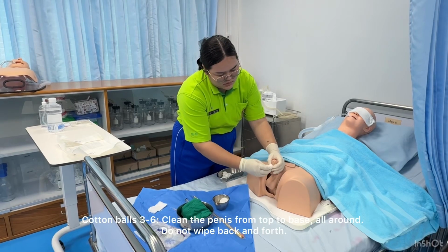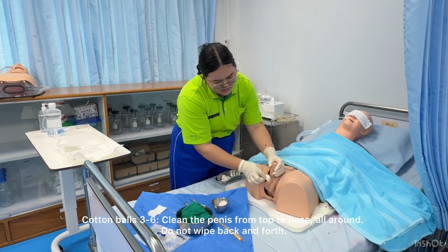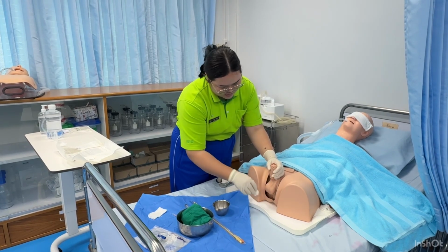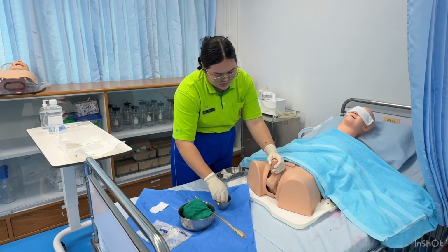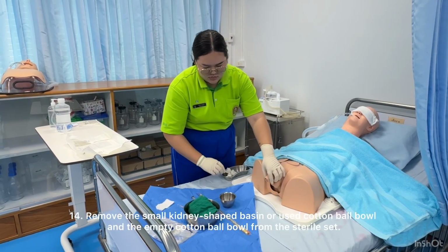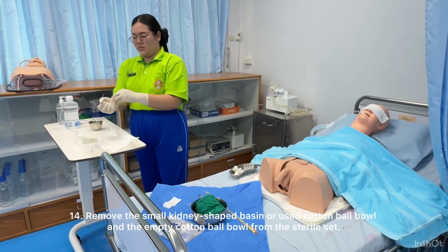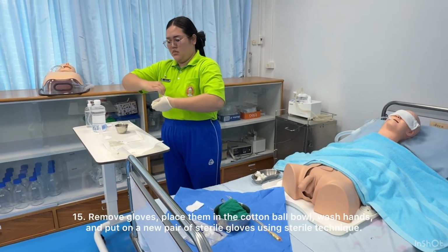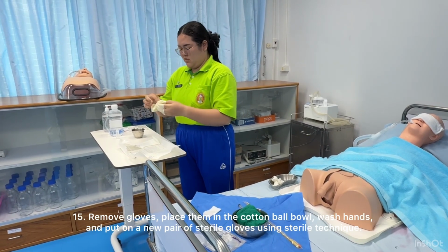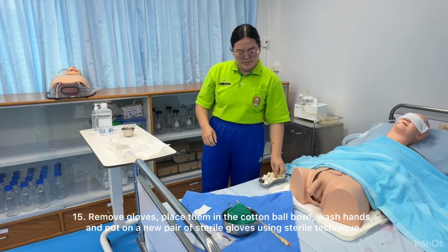Cotton balls 3 to 6. Clean the penis from top to base, all around. Do not wipe back and forth. 14. Remove the small kidney-shaped basin or used cotton ball bowl and the empty cotton ball bowl from the sterile set. 15. Remove gloves. Place them in the cotton ball bowl, wash hands, and put on a new pair of sterile gloves using sterile technique.